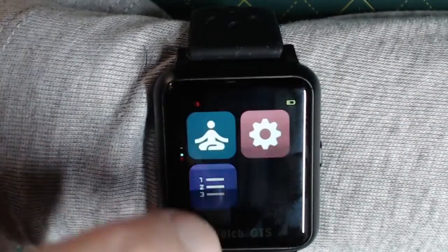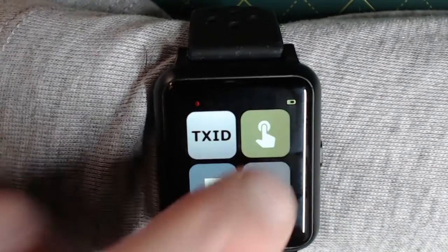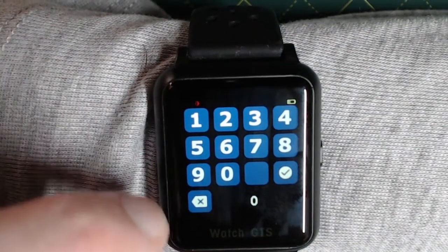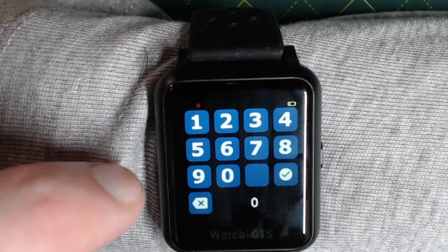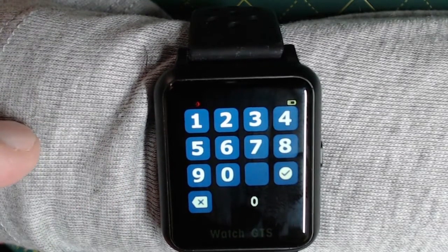Let's look at starting a sensor. Go to the Xtrip menu and then enter the sensor code. For G5, you just enter zero. For G6, you enter the sensor code — or if you want to use no-code mode, you just enter zero here as well.